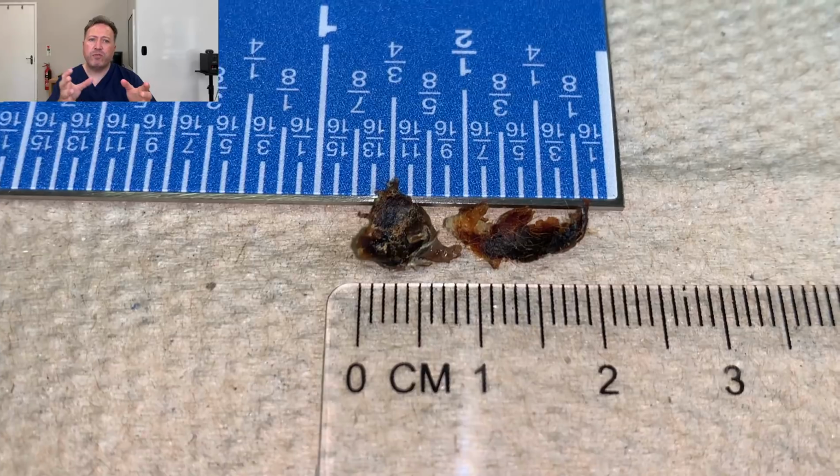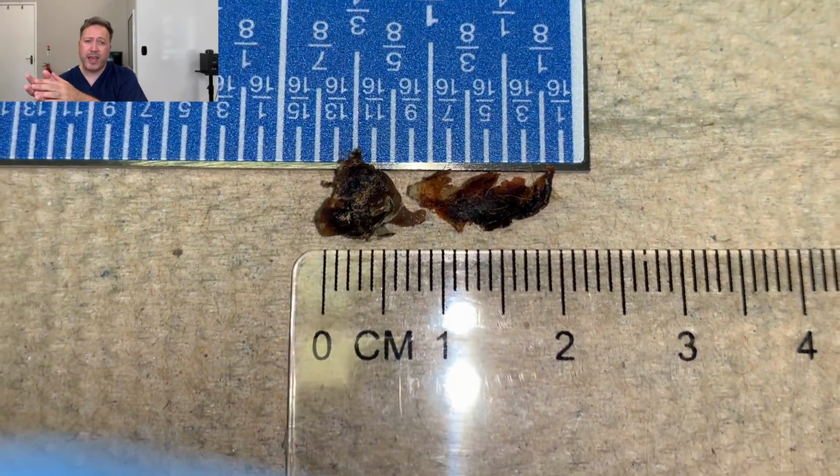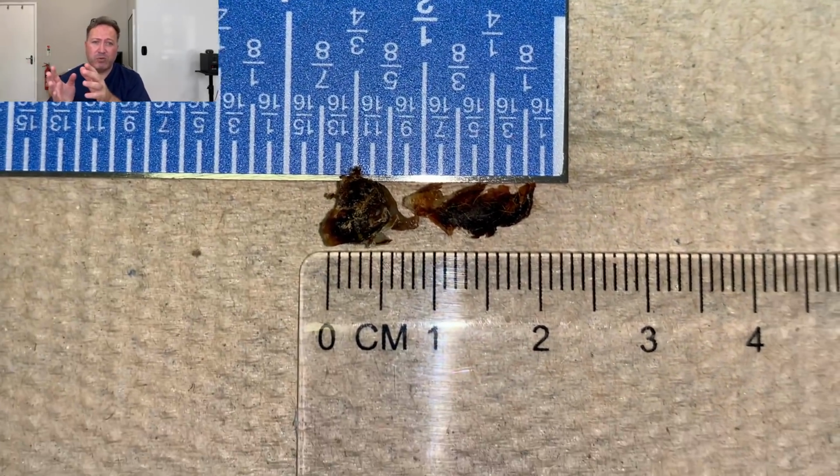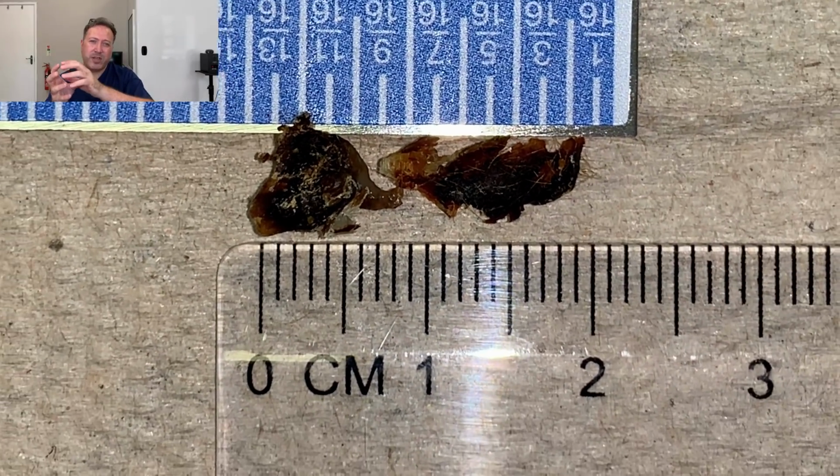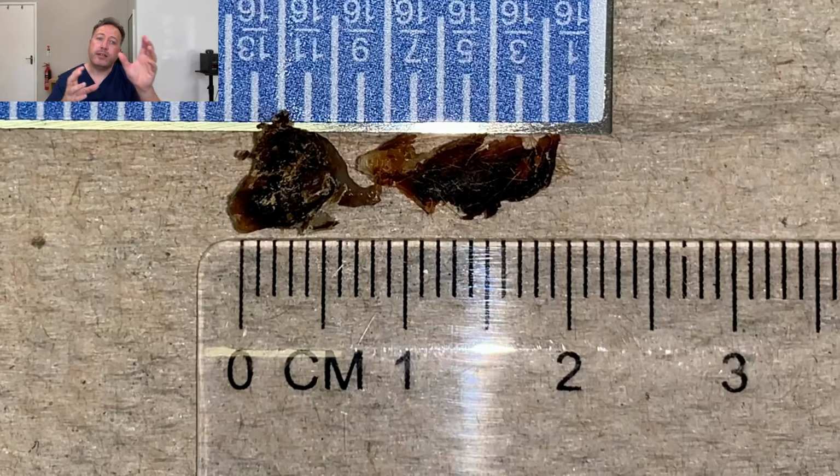So this is what we removed. The piece on the left hand side there, up to about three-quarters of a centimeter, is the first section we took away from the first ear, and then the second piece, the piece to the right hand side, is that corkscrew effect piece that we had taken away from the second ear as well. Lovely. So let's go back to my view.